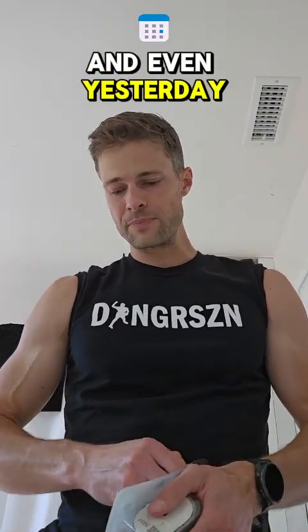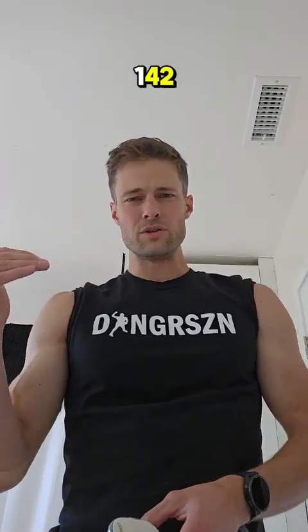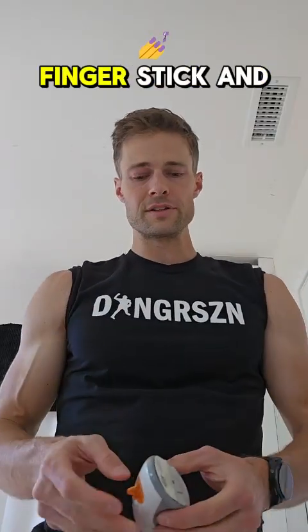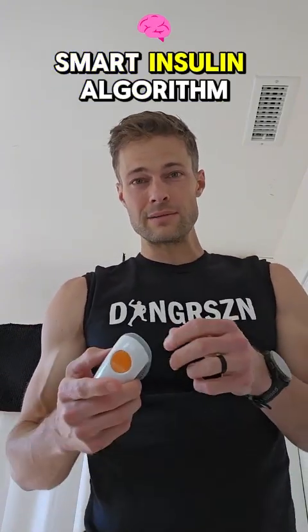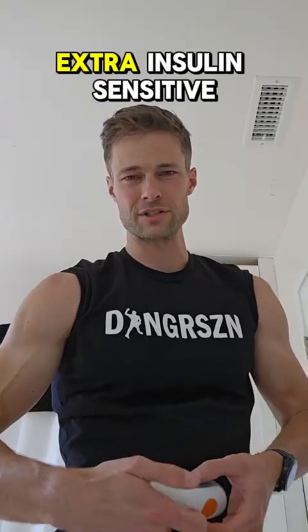And even yesterday, I saw a reading where it was like 140, 142, 143, 172. I was like, that can't be right. And I went and did a finger stick, and it was 144. And if I had dosed for that or had my smart insulin algorithm pump on, that would have been a rough situation. And I had recently worked out too, so I was extra insulin sensitive.